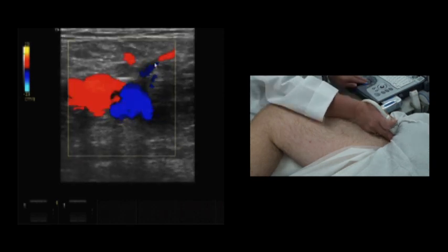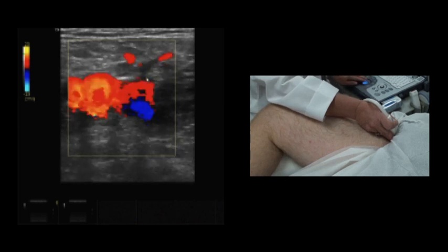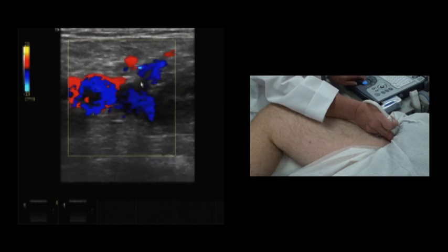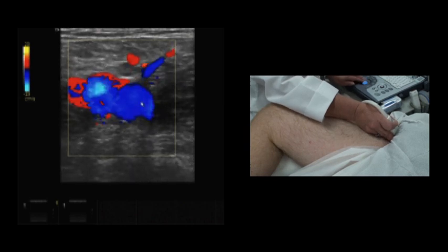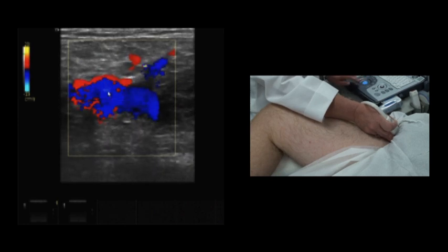We also see the takeoff of the greater saphenous. Exhale for me, please. Here we see the takeoff of the greater saphenous. And note the continuous flow compared to the more pulsatile flow.